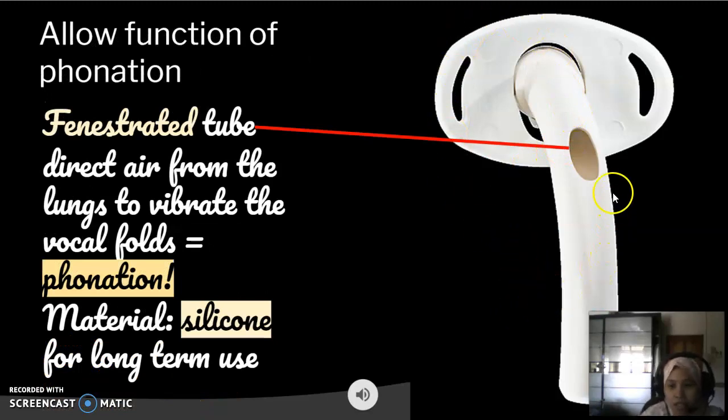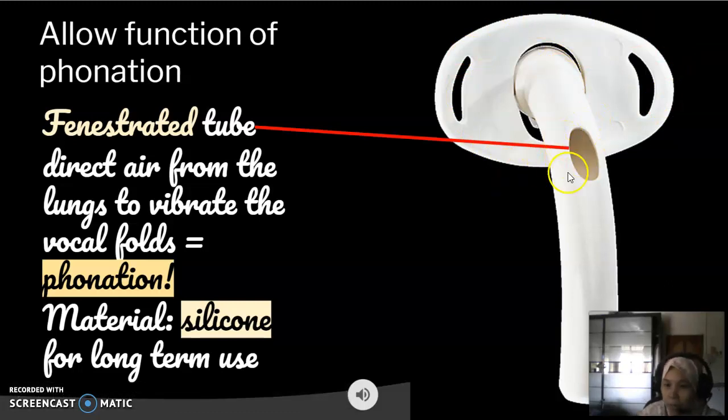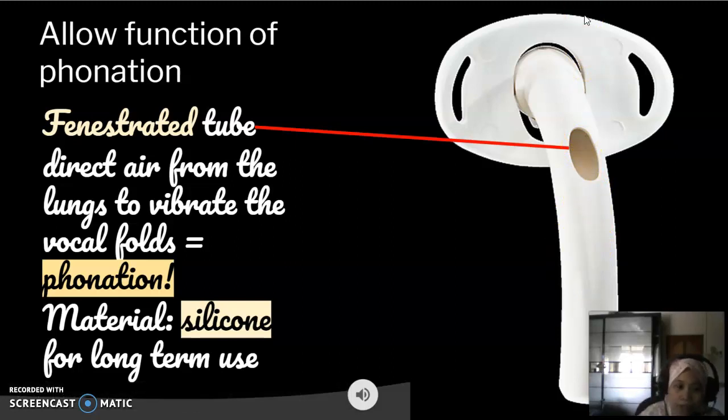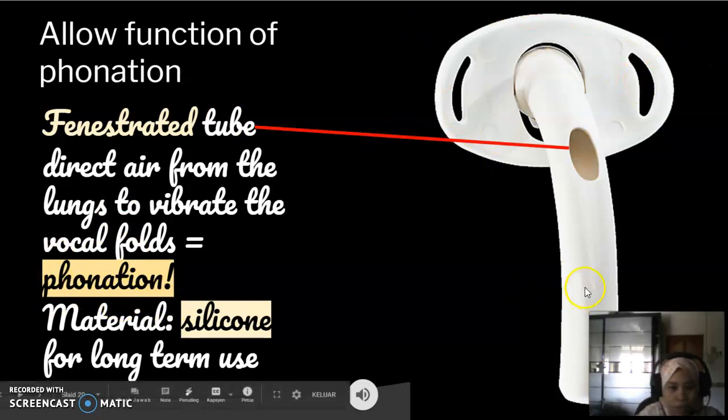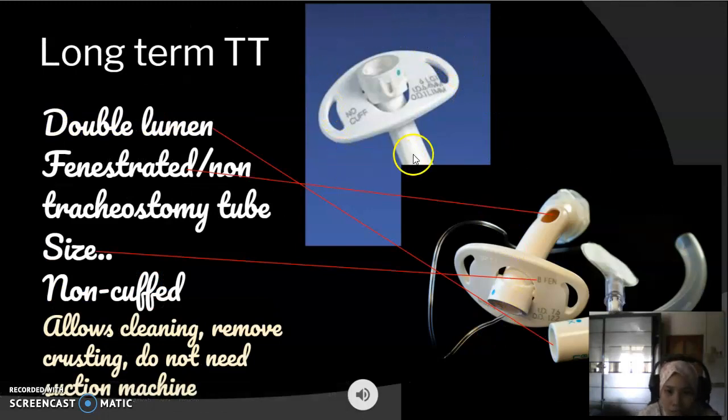This is another type of tracheostomy tube that has an opening between the horizontal limb and the vertical limb. This opening is called the fenestra, and it is present in patients with long-term tracheostomy. This long-term tracheostomy tube allows the very important physiological function of phonation. The presence of the fenestra allows air from the lungs to be channeled through the fenestra to the subglottis in order to vibrate the vocal folds, enabling the patient to phonate. This tube is made of silicone and is suitable for long-term use.